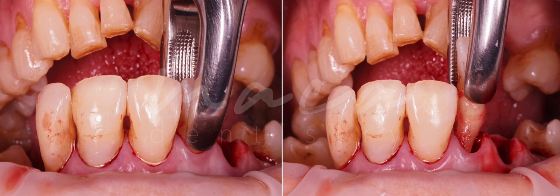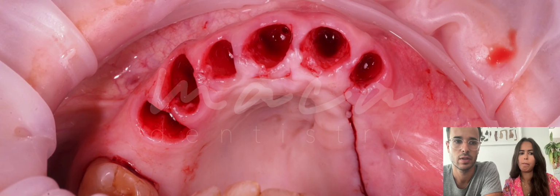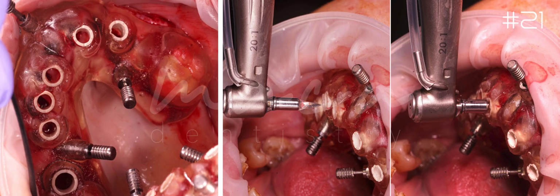Then, on the day of the surgery, the first thing to do is extractions. And we should do it very carefully in order to preserve both the hard and soft tissue as much as possible. This is an occlusal view in which you can see the post-extraction sockets that were well preserved. Also, you can see that we left both the left molars and the right molars. I think in this image you cannot see, but we left these two in order to give more stability of the surgical guide. On the second quadrant, we open a flap to place the implants on the desired position.